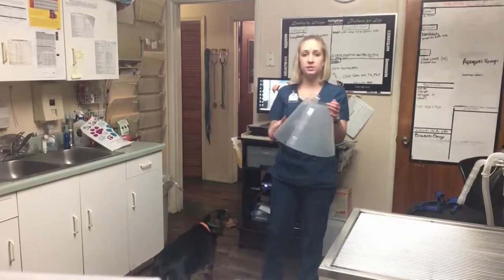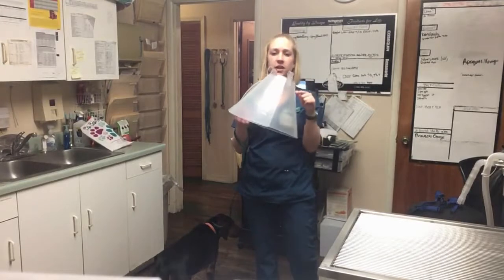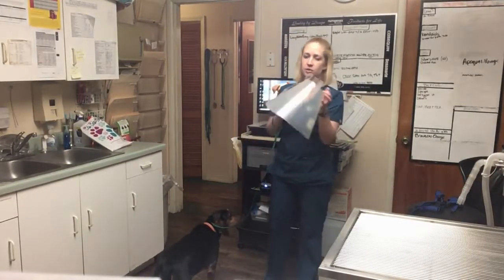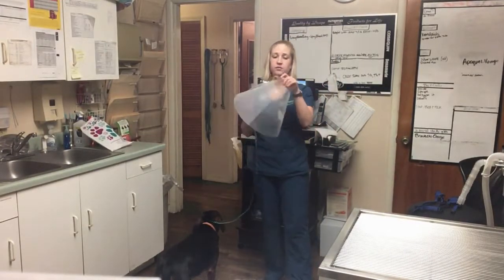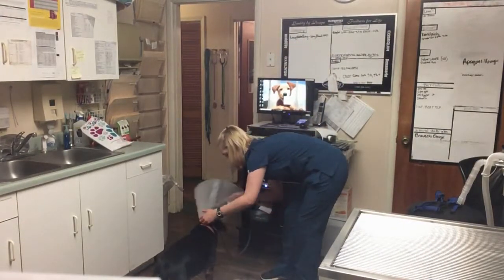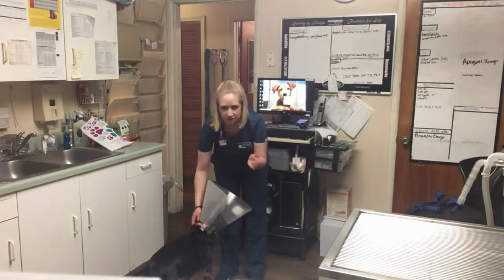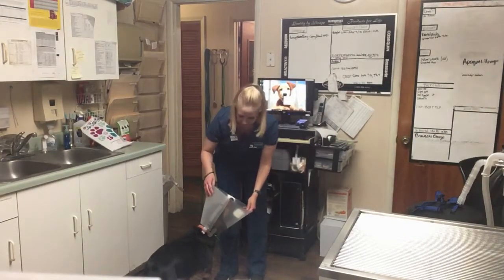Alright, so like I said, for the specific e-collar, it does come with loops that you are going to feed his collar through. So you'll take the collar off, and then you'll feed the collar through, and then you will just slip it over his head, like so. Slipping it through the collar will add an extra little layer to help make sure it does stay on his head.